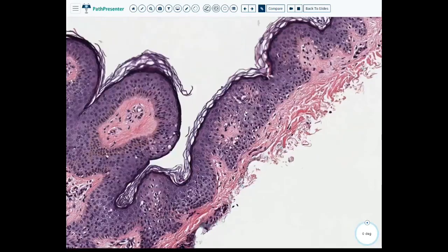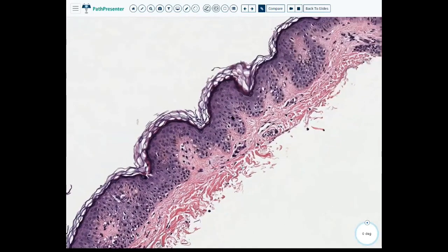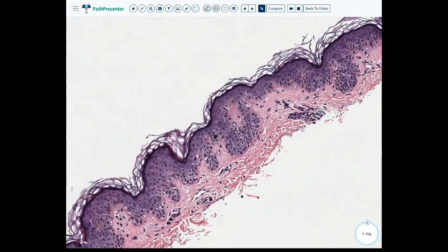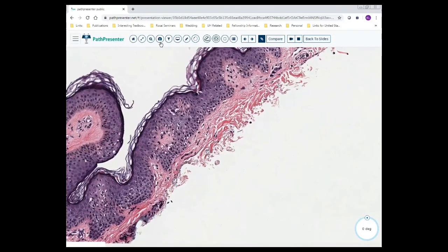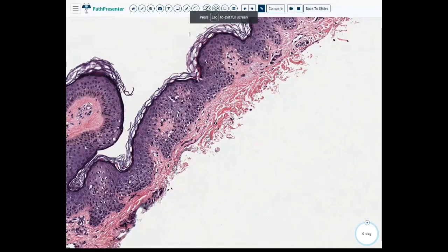And that beeping tells me someone has a pager that wants a new battery. Okay, oops. We'll just add a full screen there.